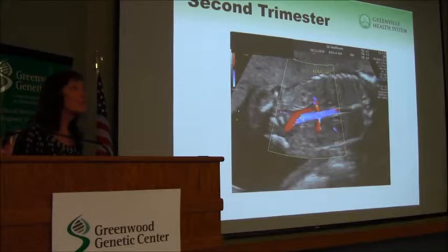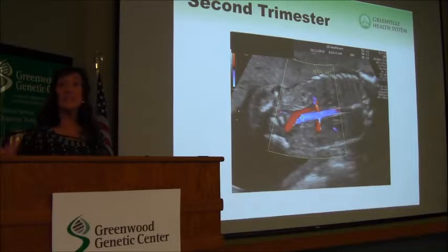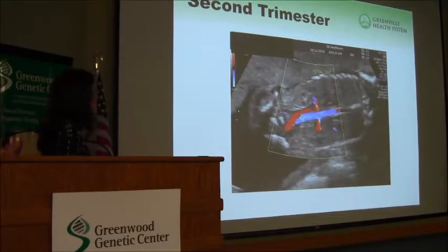The adrenal glands look a lot like kidneys if you just see them on cross-section. So now that we're looking for this, we're finding more pelvic kidneys and more isolated renal agenesis. Certainly, if there's bilateral renal agenesis, they usually show up with very low amniotic fluid, because the amniotic fluid is produced by fetal kidneys once you get into the second trimester.